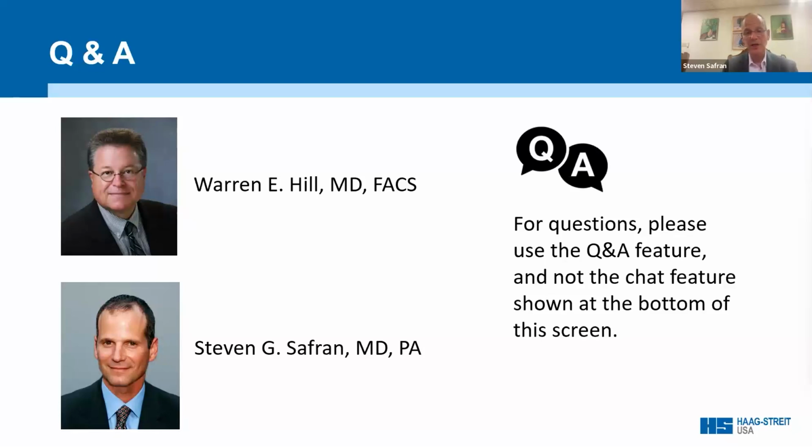Again, especially since we're using these 0.75 or 1 diopter step toric lenses, and I'm actually trying to overcorrect against the rule and undercorrect with the rule anyway. So I basically try to ask myself, well, what is the patient going to be most happy with if I overcorrect or undercorrect that. The Barrett formula, again, does a very good job in estimating. Now, some of these eyes have funny posterior corneas, like if I'm doing a post-graft patient, all bets are off in some of these eyes. They can have weird posterior corneas.